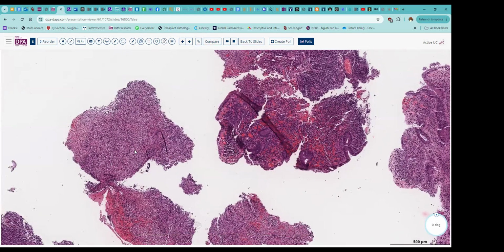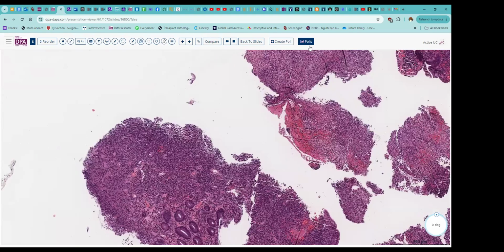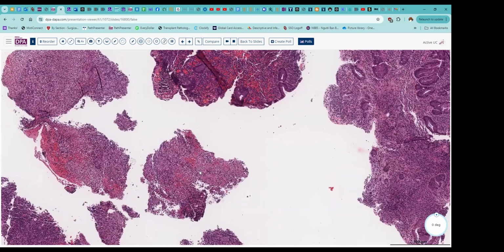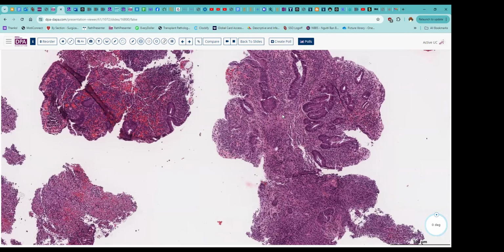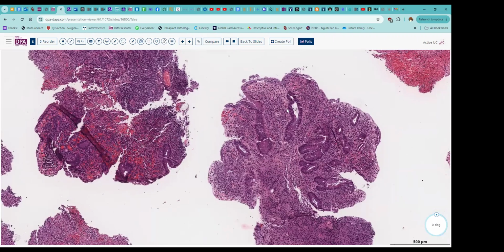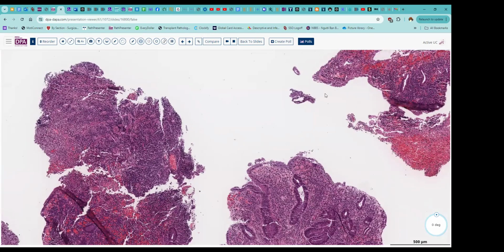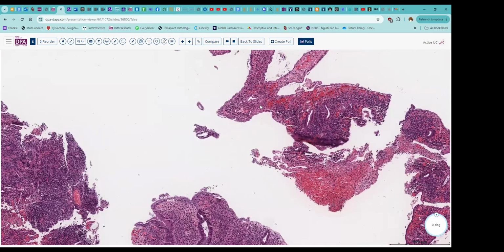Now, I'm not an expert on the application of that system. I've never been trained in it. I've just read the literature and tried to apply it in a general sense. But I think being descriptive about the features that you have can be helpful in the case of inflammatory bowel disease.